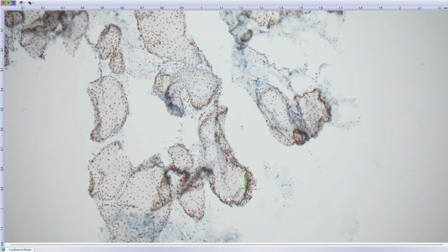Before, people still thought this was an epithelial tumor; all those trichoblastomas are just reactive hyperplasia over it. I gave you already a reprint of it. We did about 25 cases of this years ago, which is now very widely cited, and this theory of ours is recognized.